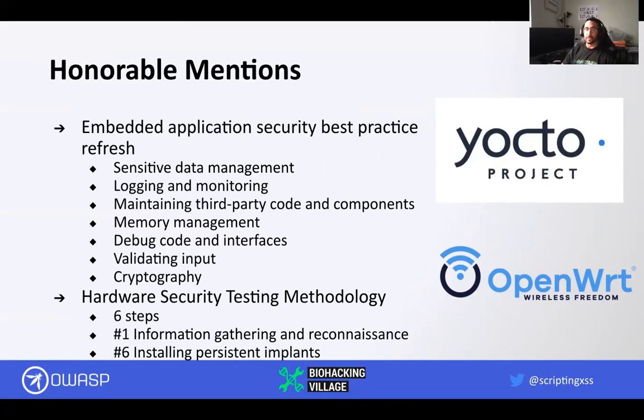And the hardware security testing methodology is also a work in progress. Again, this takes that step even lower than firmware, to the stage where you have the hardware, and let's say you need to pull the firmware and find vulnerabilities and then exploit them. This hardware testing methodology will help you in that endeavor when you're embarking on those types of hardware analysis assessments: the tools you'll need to have in your toolkit, the techniques you'll have to keep in mind, and when to try which technique.